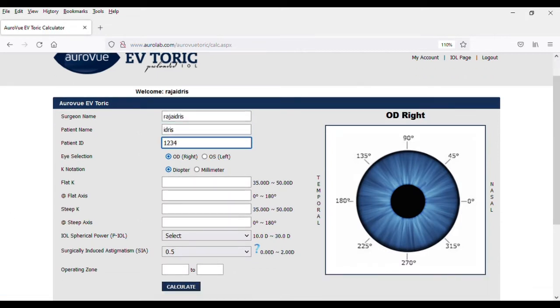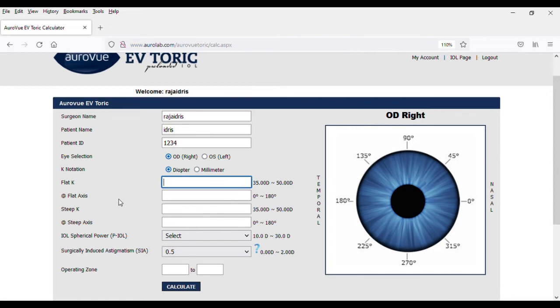Once the calculator is accessible, please make sure to have the prerequisite information along. These include the K reading, the incision location, and the IOL spherical power.